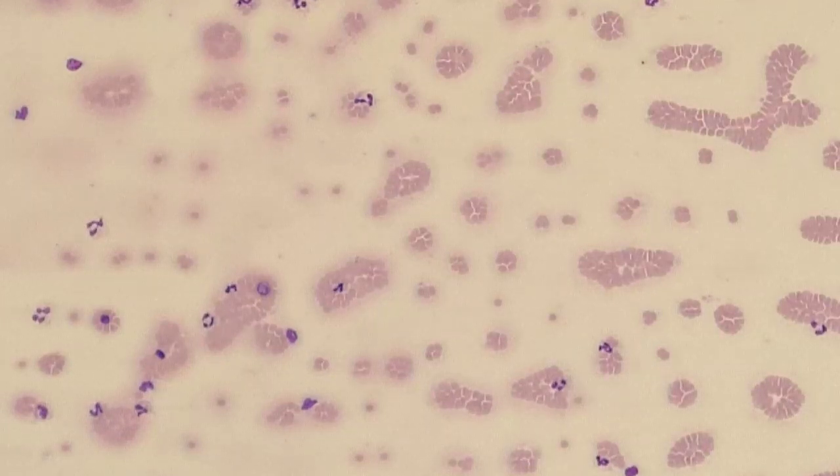They tend to be the largest in the sequence of cell maturation in the bone marrow. So if we have a patient who is releasing blasts into the peripheral blood, of course that is abnormal, and that is something that we absolutely would want to catch. We'd want to see those blast cells.